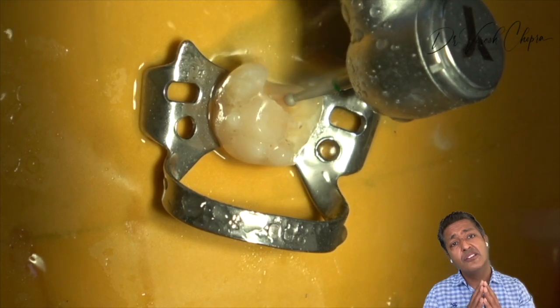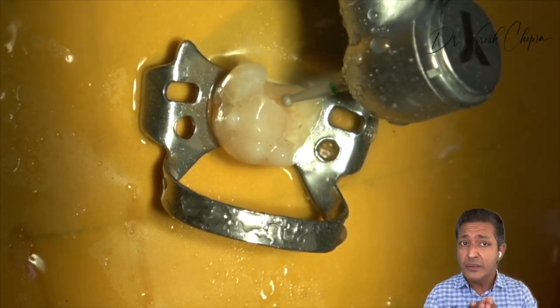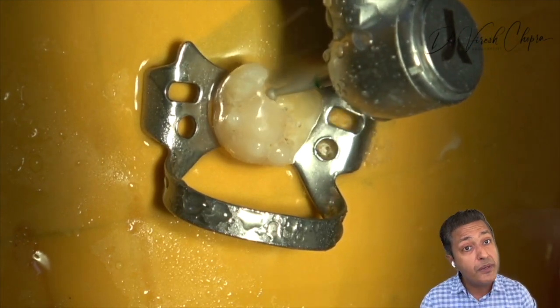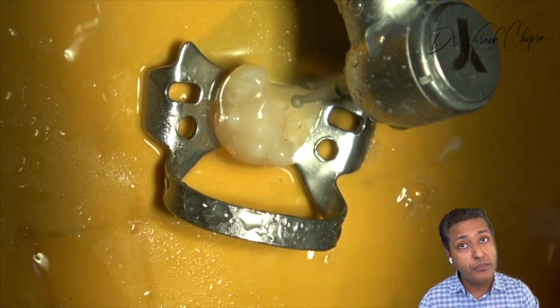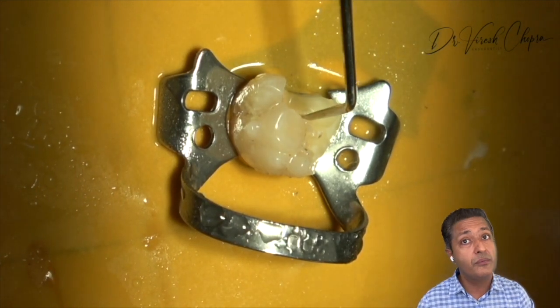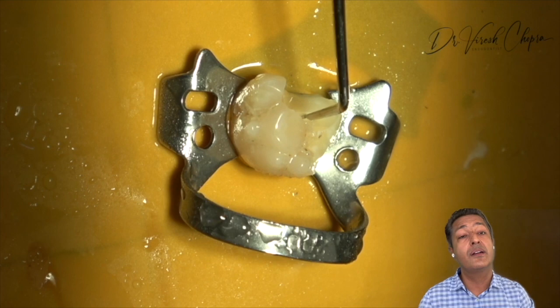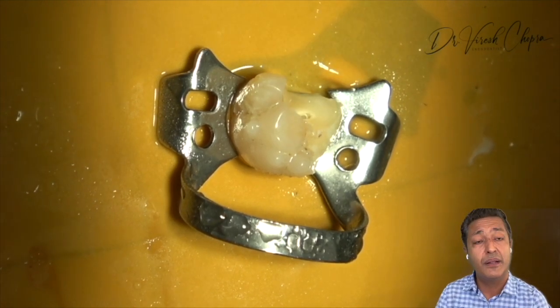If the carious lesion is approaching the pulp, you will see an exposure. But if you are doing heavy-handed dentistry, or you need to jump into the access cavity or the pulp chamber, then you will feel a drop. Once you see the exposure, confirm that exposure site with the DG16 Explorer or the Endodontic Explorer, so that we know that we have entered the pulp chamber. This is the entry to the pulp chamber.